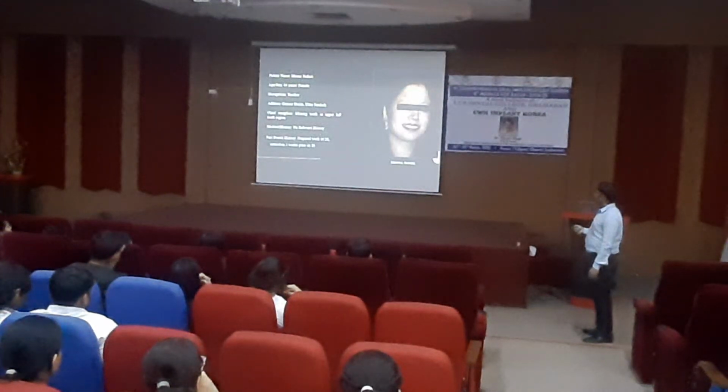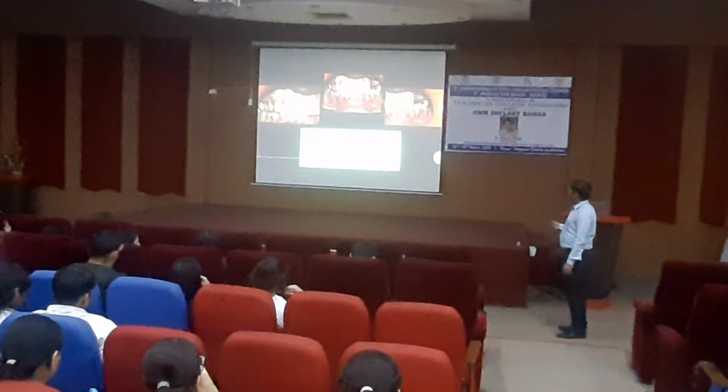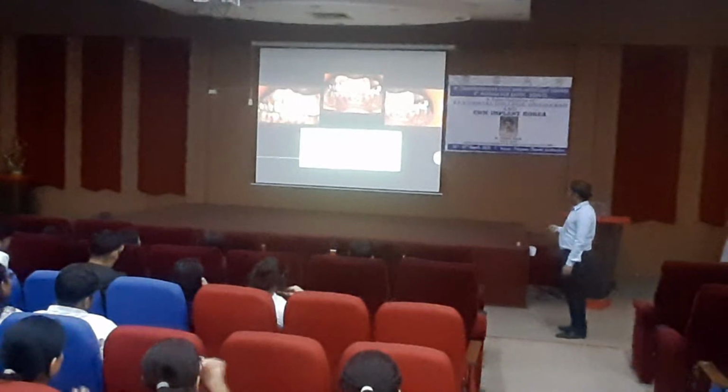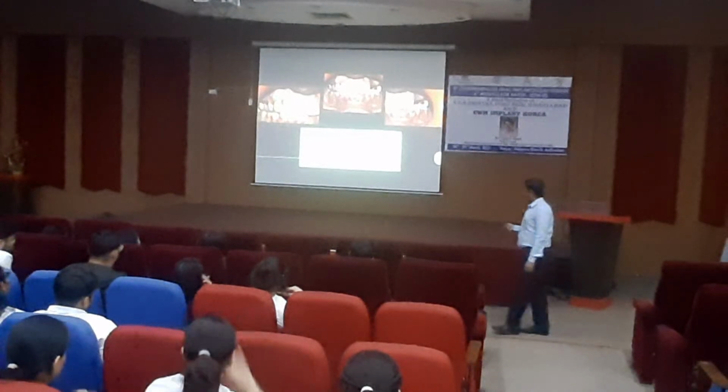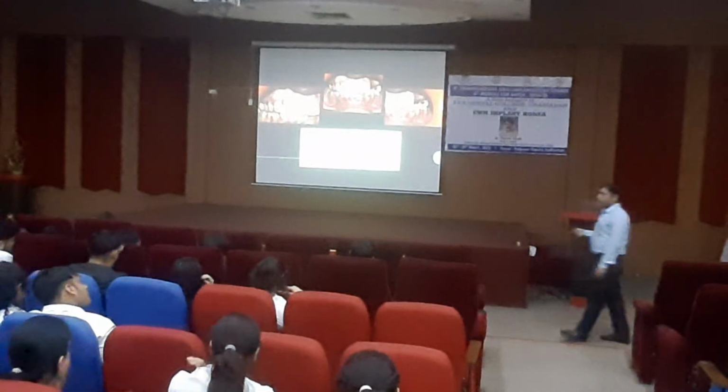So this is another case for osteodensification. If you see here, there is an edentulous area, and the amount of interarch space is 12 mm, and mesiodistal width is around 5 mm and 8 mm, and quality of bone is D3.